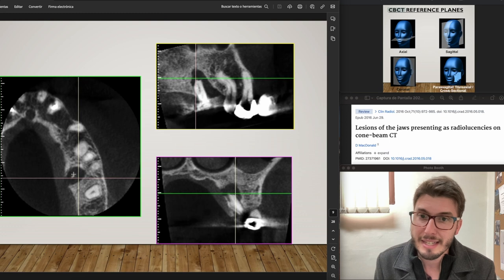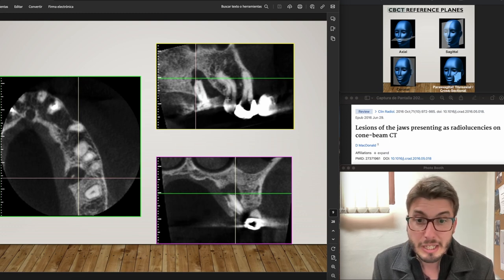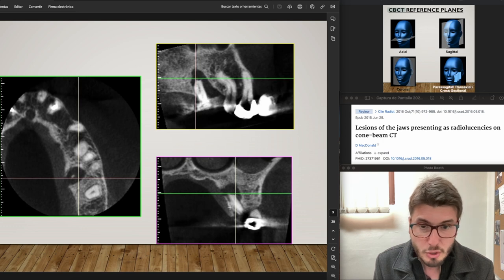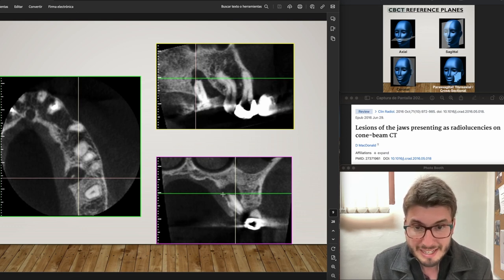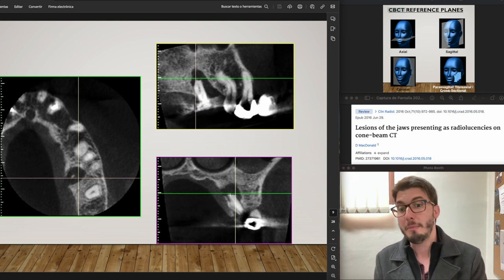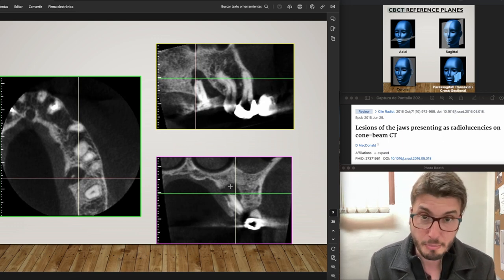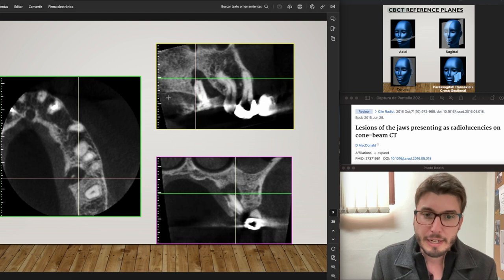This is the diagnosis of a palatal root, and now we have an endoperial lesion with fenestration of the palatal plate as well and root resorption. That's why the apex now has a different shape.